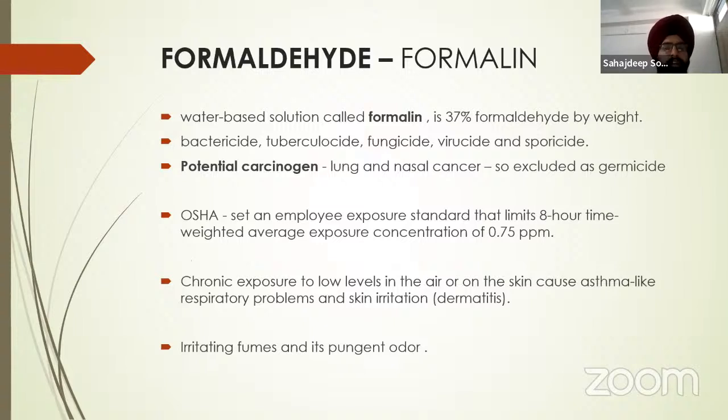Then comes formaldehyde, or the last of the aldehyde group. It is used as a 37% concentration, which comes by name of formalin. It is bactericidal, tuberocidal, and fungicidal, and even sporocidal. But because of its potential carcinogen effect, which it causes lung and nasal cancer, it is not being used as germicide. Occupational health agencies of USA have set an employee exposure standard of 8-hour time weighted average of 0.75 ppm because of its potential carcinogen effect.